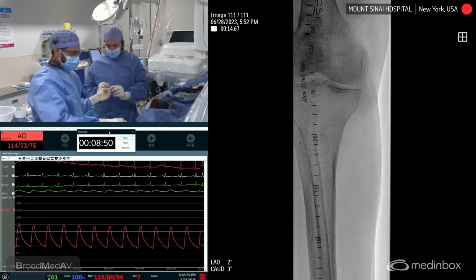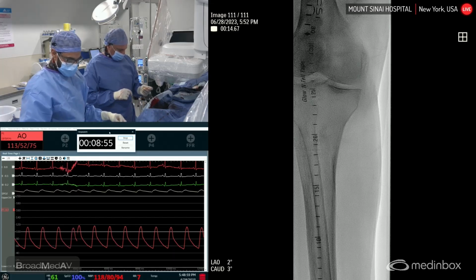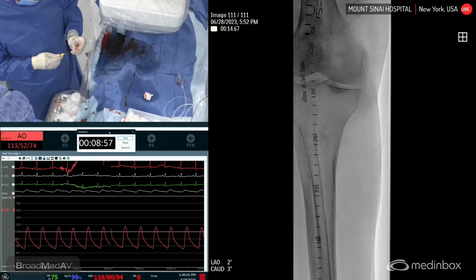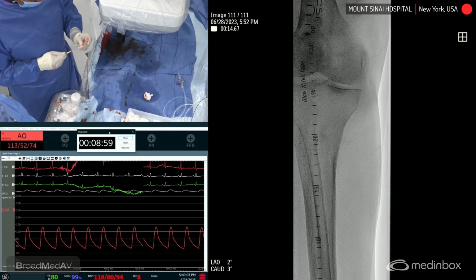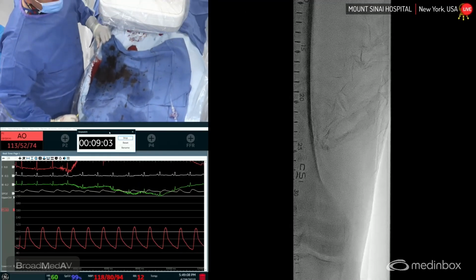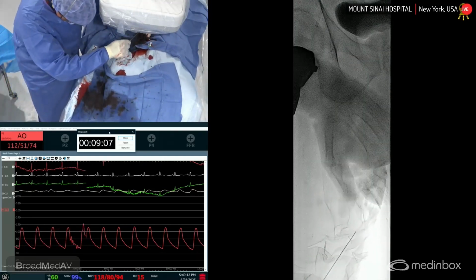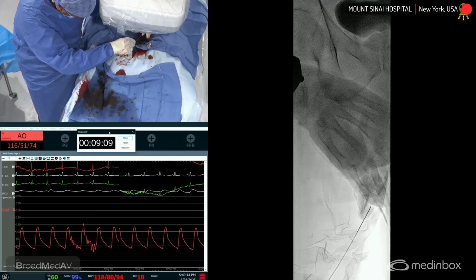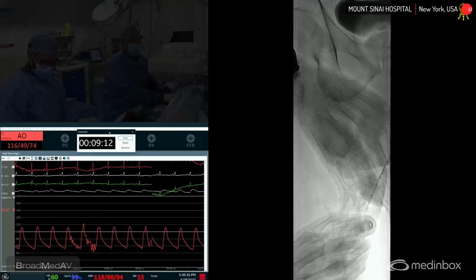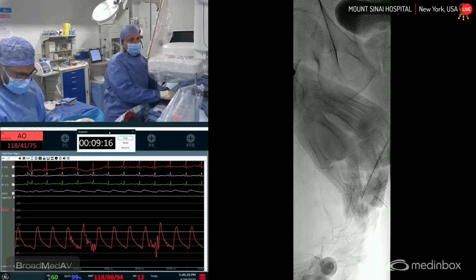So you're saying leave it, huh? What's the reason to fix it? Just because we did the work? The reason to fix it is to try to keep the patency, I guess. Well, we don't have any data that suggests it helps, but it would make intuitive sense, right? And also, if this closes, then it's going to reduce our patency for sure. So let's, I mean, we'll see.